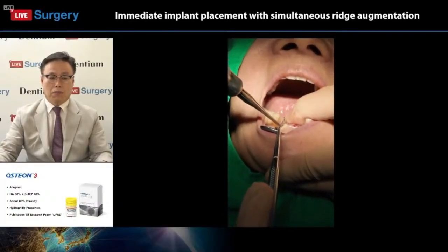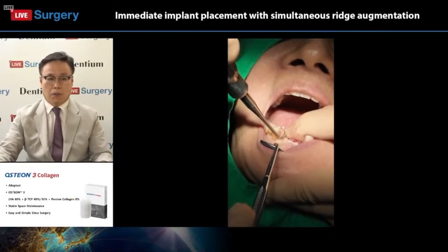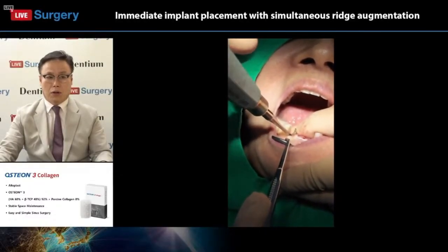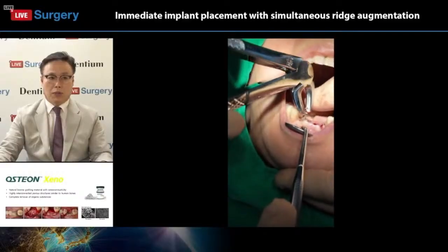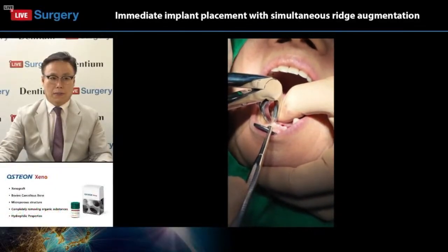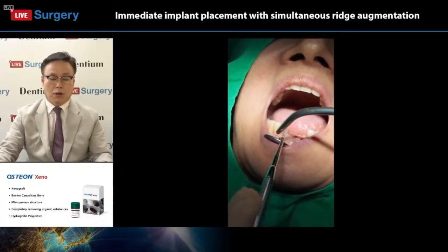the trauma. Sometimes when you apply force with the forceps, it could slip to the lingual side and cause some damage to the mouth floor or tongue. Therefore, I protect the mouth floor and tongue with the other hand, and perform the luxation safely without any major trauma.